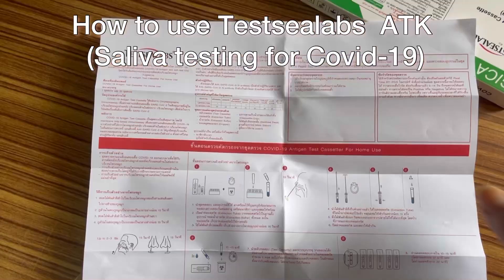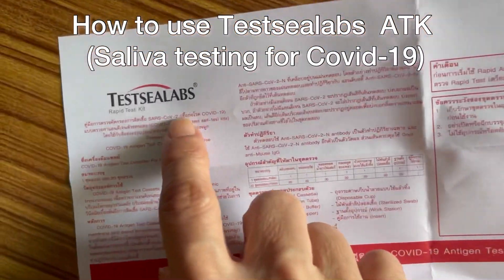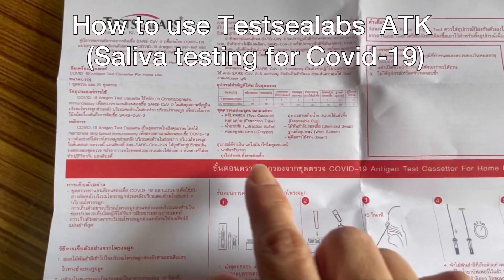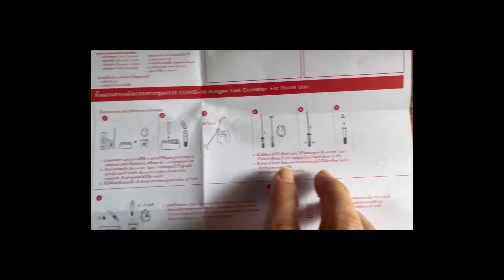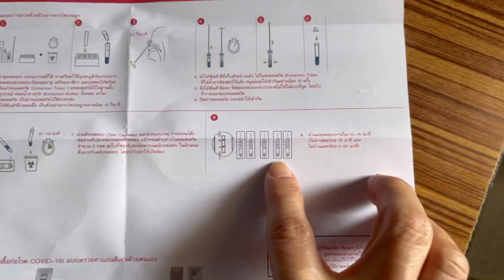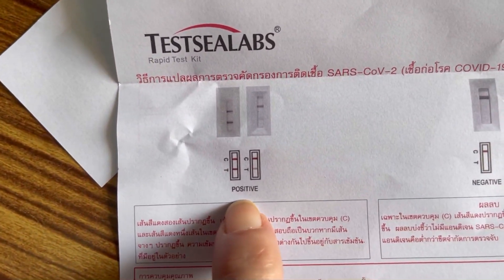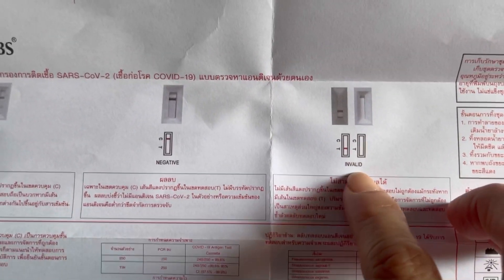The pamphlet is written in Thai language, so I'm afraid you cannot follow the instructions properly. But look at the symbols and illustrations — if you can read those, it should be okay. It's better to ask a Thai speaker if you cannot understand. You can also read the positive, negative, and invalid results shown here.